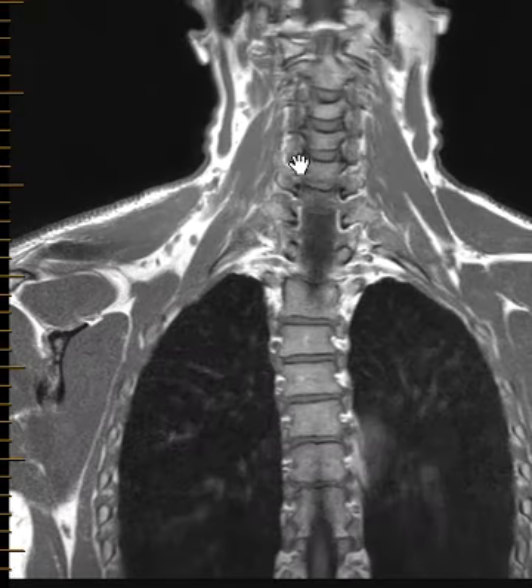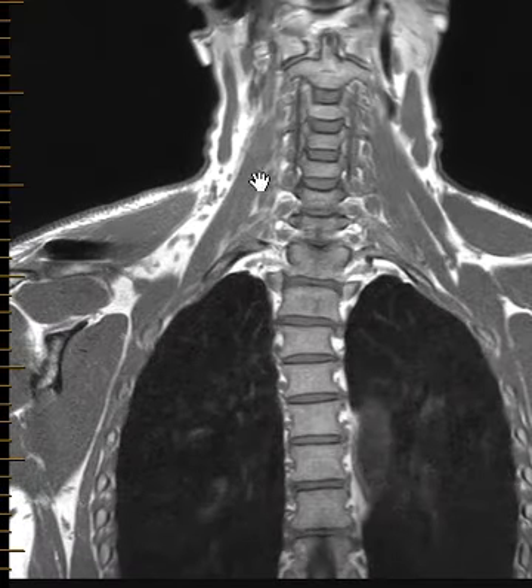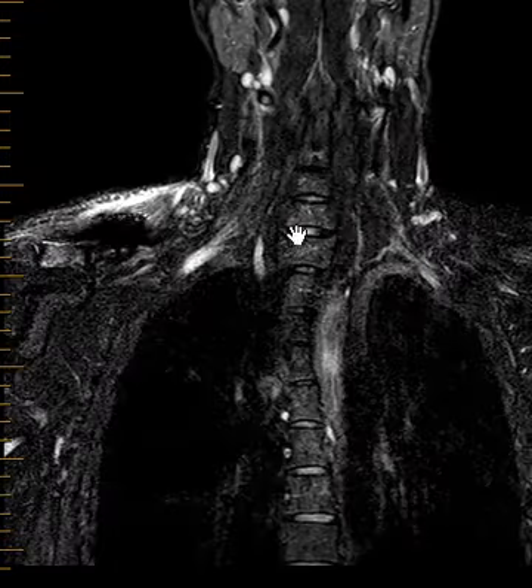To go over the anatomy, there are roots, trunks, divisions, and cords. Right where they come off, we have five roots starting at C5, C6, C7, C8, and T1. The root region is about where the muscles are — think about things right by the foramina and going off towards or in between the muscles. You can look here for traumatic nerve root sleeve avulsion; if you see fluid out here, these are the regions of the roots.